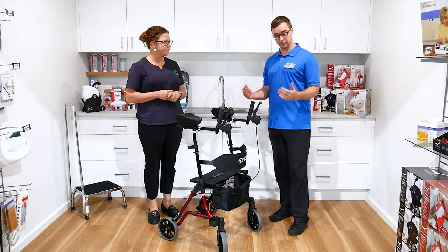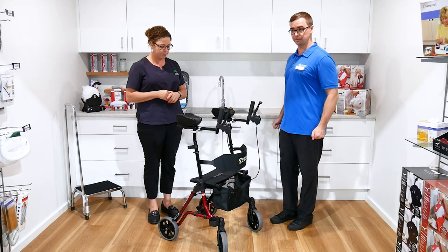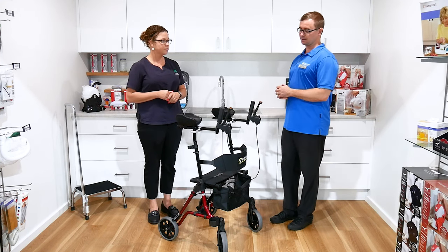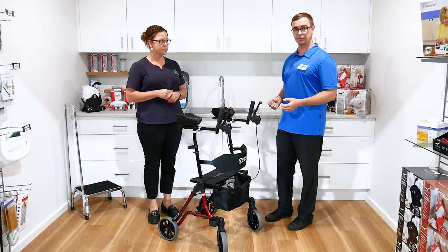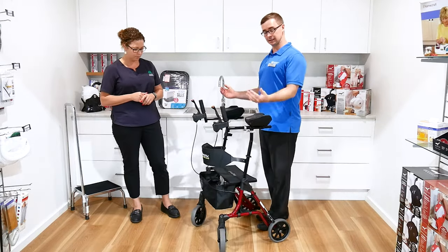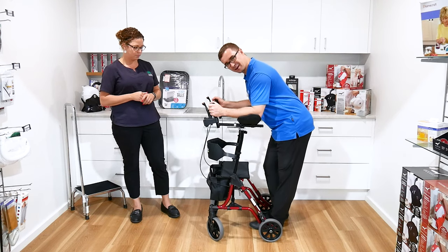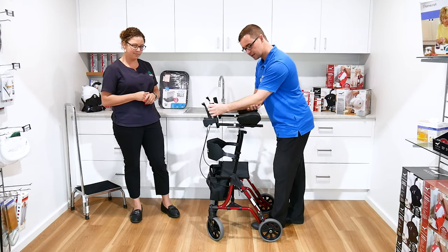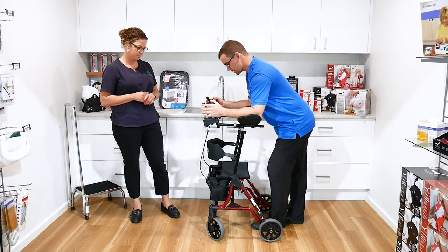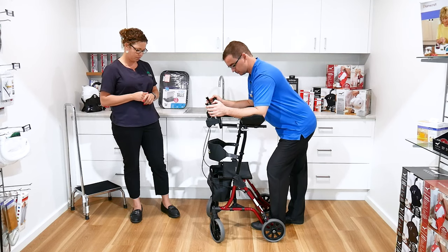A forearm support frame — a lot of people may not have seen these before. Classically for mobility devices, people probably think about walkers or rollator frames. A forearm support frame, exactly how the name is describing, gives the user the ability for more upper limb support. This is not at the correct height for myself, but just for demonstration, it gives nice support through the forearm while walking to allow more upper limb dependence with mobility.